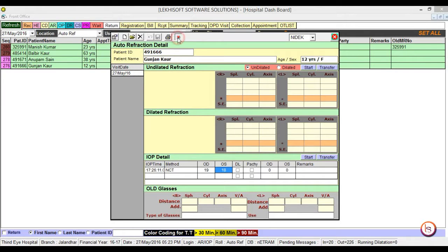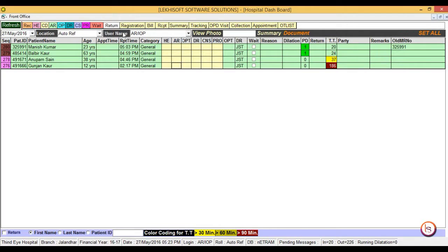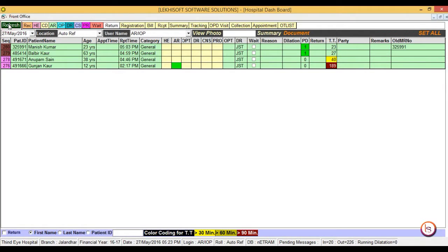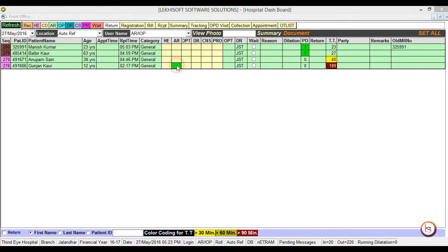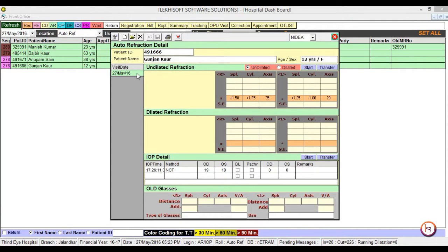Close it. Now refresh the dashboard. If we again open the same patient, the color of field is green as the record is completed.